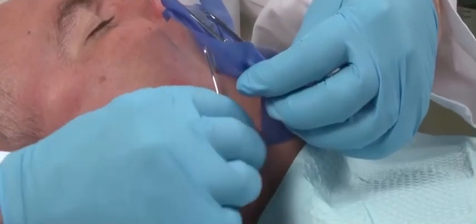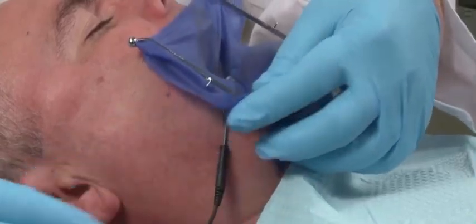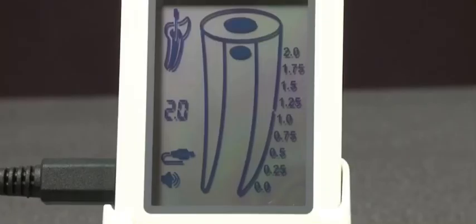Place the lip clip into the patient's mouth. Connect the file clip to the file. NDOE's Find will automatically detect the root canal measurement has started.